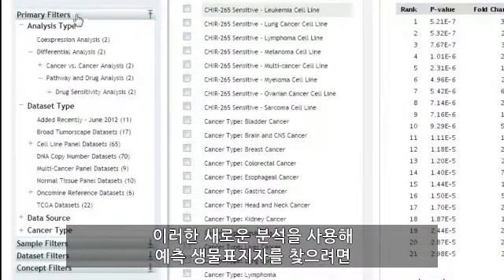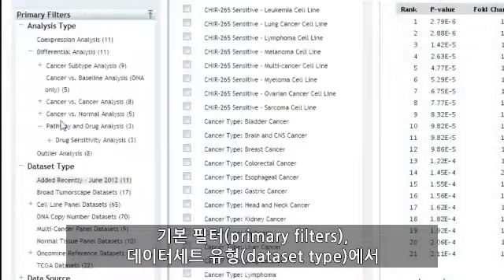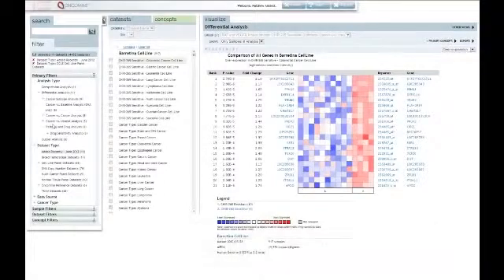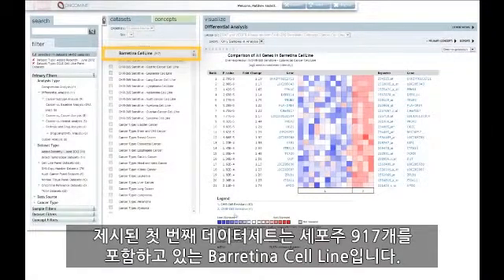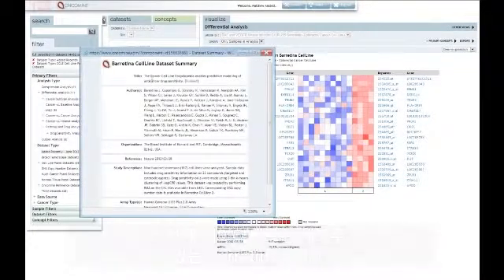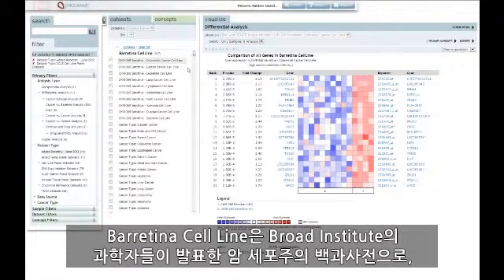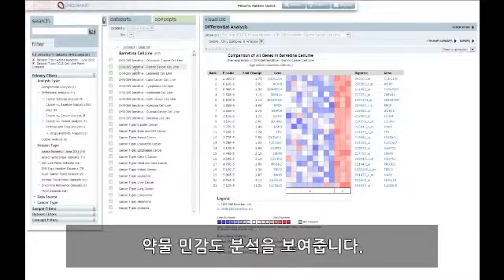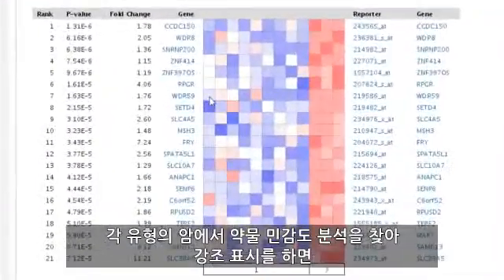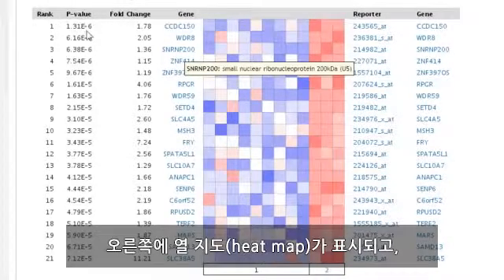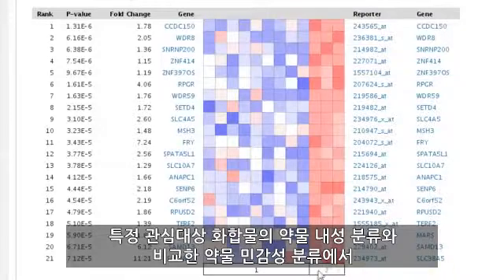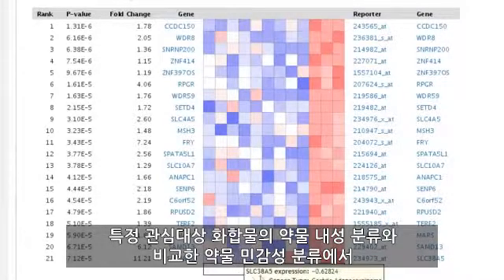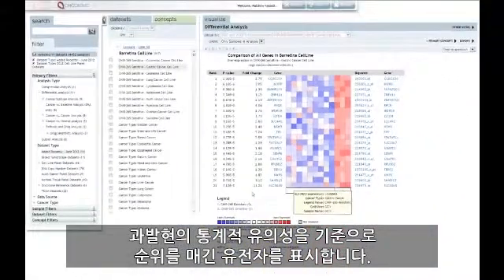To begin looking for predictive biomarkers using these new analyses, select the recently added datasets filter under Primary Filters, Dataset Type. The first dataset shown is the CCLE cell line, which contains 917 cell lines. The drug sensitivity analyses comparing sensitive cell lines to resistant cell lines within multiple cancer types are shown. Browsing and highlighting the drug sensitivity analyses within each cancer type will retrieve a heat map to the right, displaying genes ranked by statistical significance for overexpression in the drug sensitive class compared to the drug resistant class for the particular compound of interest.